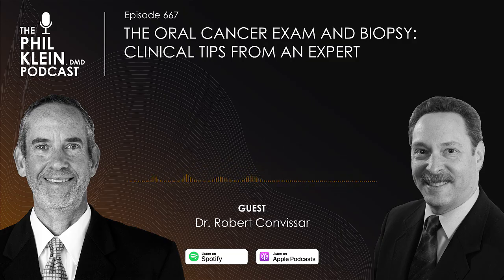So there are many lesions you can do with a punch biopsy. There are plenty of lesions that you can do the old-fashioned way with a scalpel. Scalpels work beautifully. If you're well trained, you can do them with radiosurgery and electrosurgery. Just take a slightly wider margin so there's no effect on the tissue. I've been using lasers for biopsies for over three decades. And if you know the tool that you're using, a laser, radiosurgery, electrosurgery, whatever, you should have no problem whatsoever doing a biopsy correctly. It's training and using the tool correctly more than anything else.